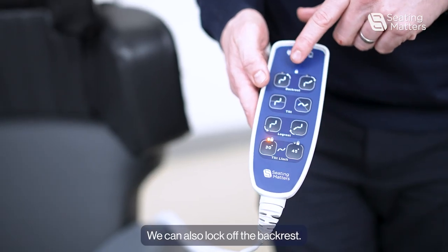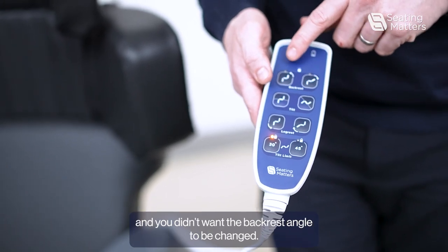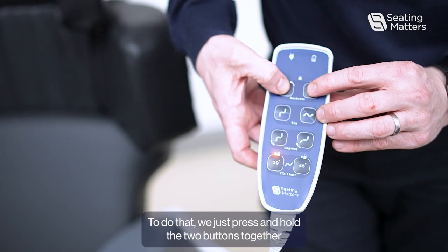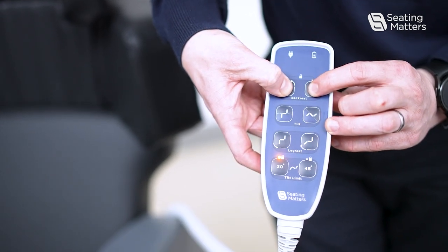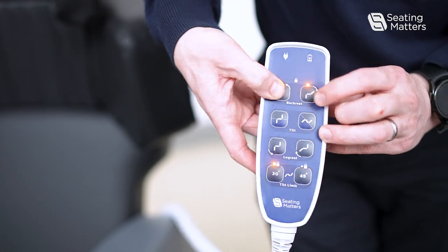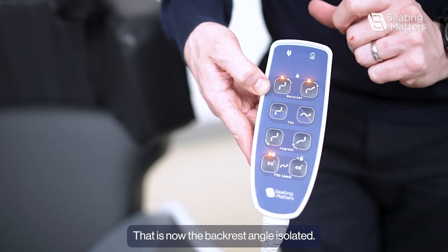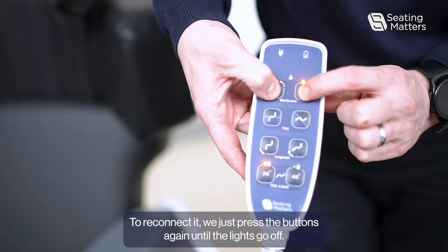We can also lock off the backrest. This would be useful for a patient who was maybe fixed at the hip and you didn't want the backrest angle to be changed. To do that we just press and hold the two buttons together until the lights come on. That is now the backrest angle isolated. To reconnect it we just press the buttons again until the lights go off.